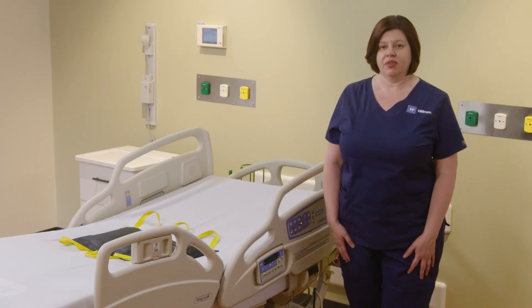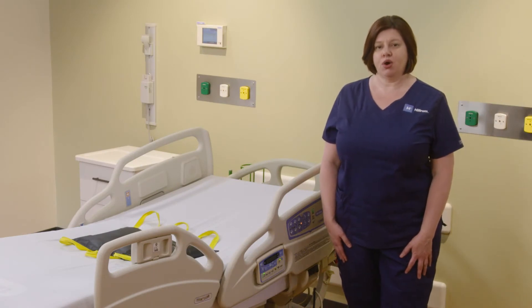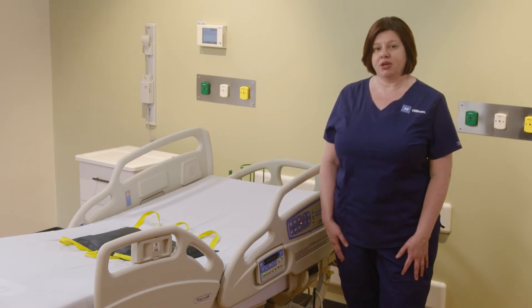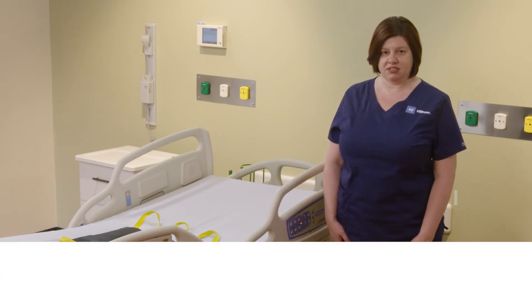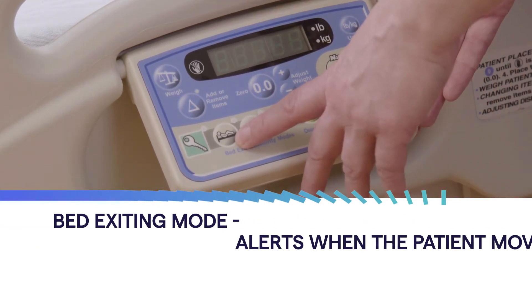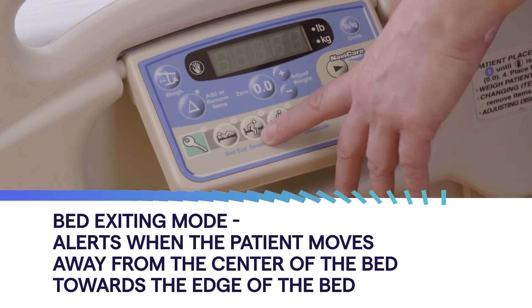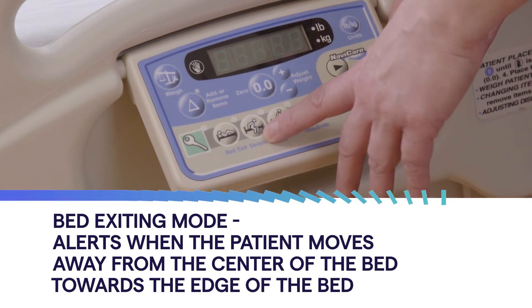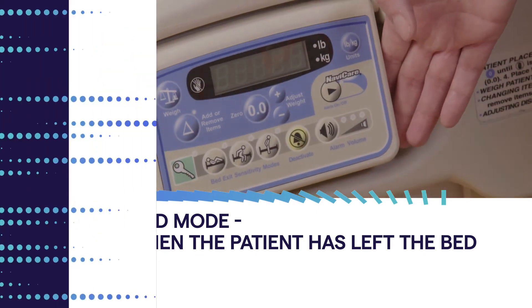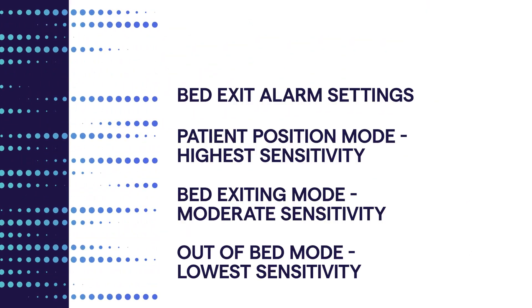The Care Assist bed features a three-mode bed exit system. The three sensitivity levels are: the most sensitive setting is positioning, followed by exiting, and then out of bed. Select the sensitivity level most appropriate for your patient.